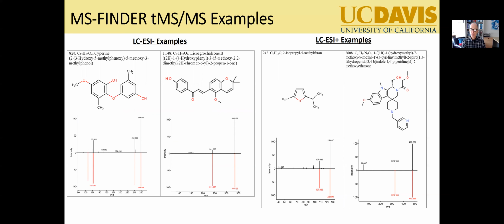Between the inability to get a targeted MS-MS result for these samples, so there were many compounds we could not obtain a targeted MS-MS result for, and among the ones that we did get a targeted MS-MS, there was often not enough abundance to do very much with. So further efforts to concentrate, select, and purify would be helpful here, and we're working on improving this set of results.